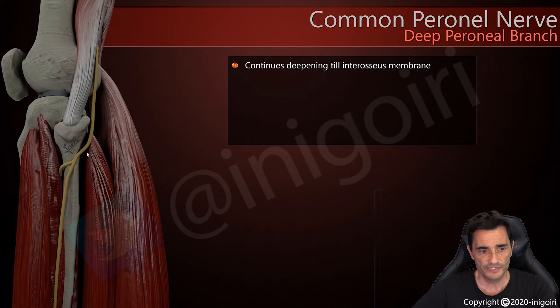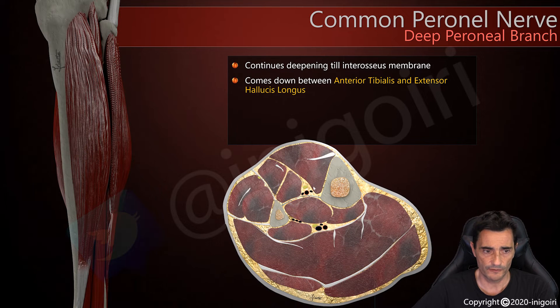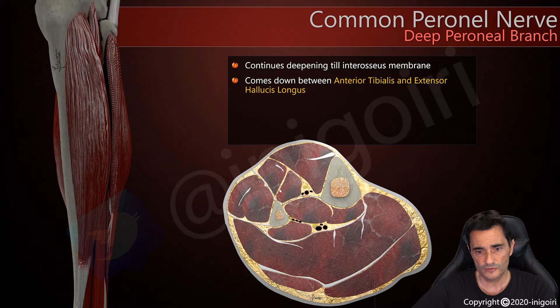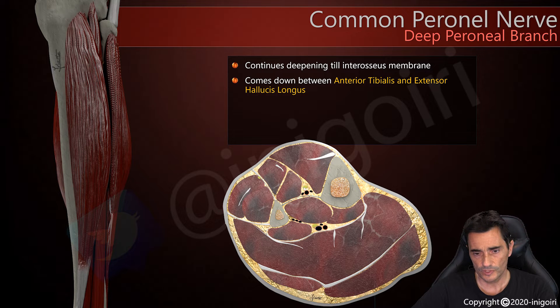The deep peroneal nerve continues deepening until it reaches the interosseous membrane. It is located below the muscles of the anterolateral compartment of the lower leg, between the tibialis anterior muscle and the extensor hallucis longus muscle, very close to the interosseous membrane and also very close to the anterior tibial artery at this level.